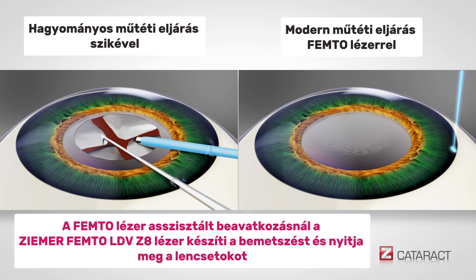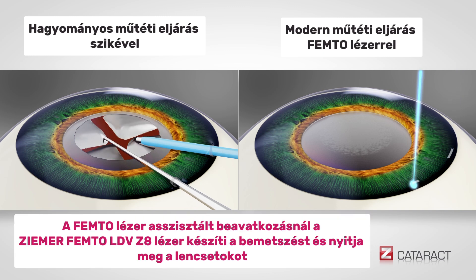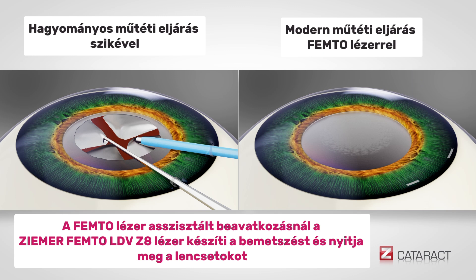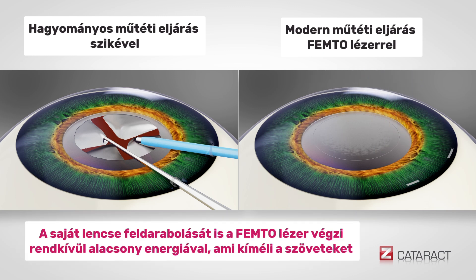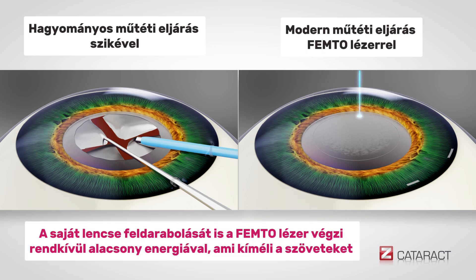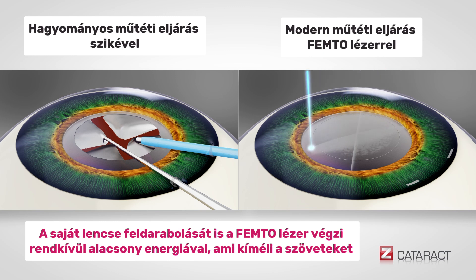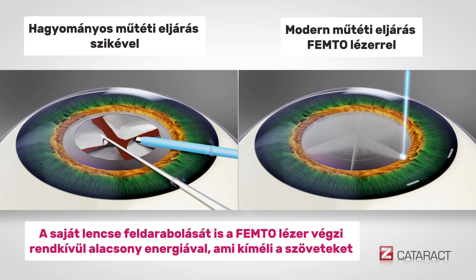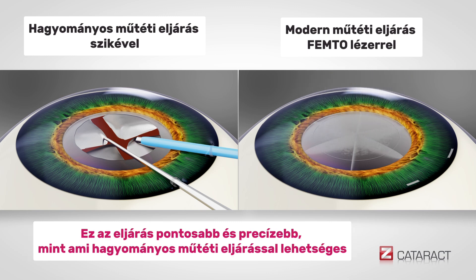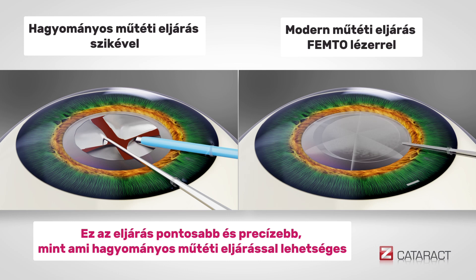With the Z-Cataract procedure, the Zemer Z8 laser creates the incisions, the capsular opening, and the pre-fragmentations in the clouded lens with low energy, in a manner that is much more precise and with a consistency far superior to what is possible with manual techniques.